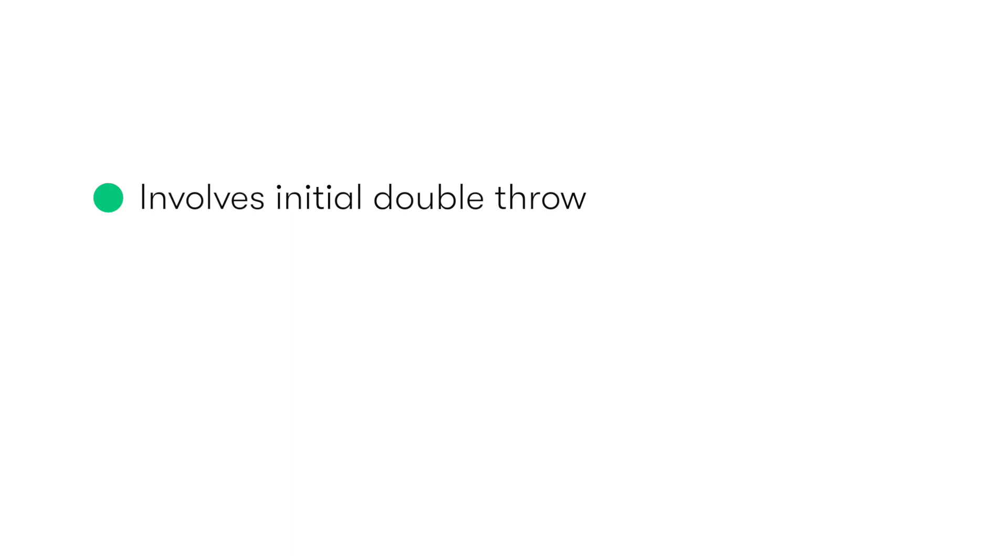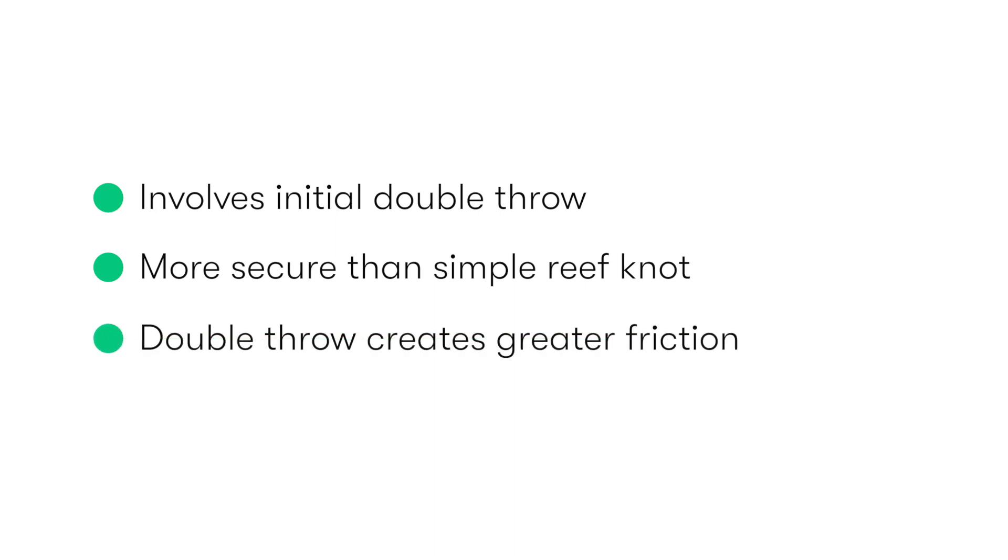The benefit of the Instrument Surgeon's Knot is that it creates a knot that is more secure and won't slip between throws. It does this because this initial double throw creates more friction between the suture material and stops it from loosening.